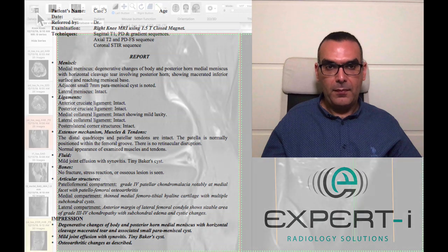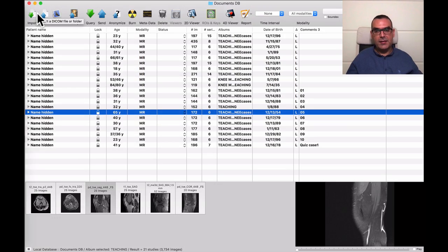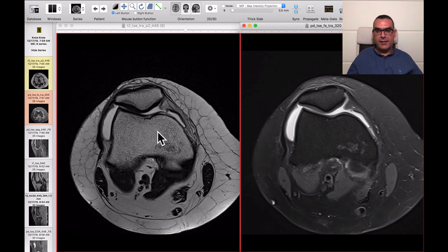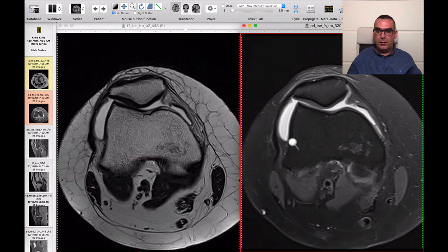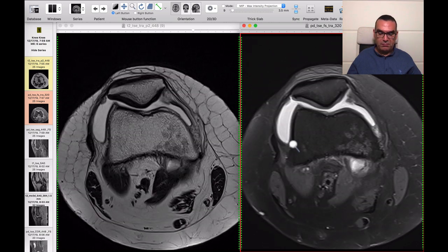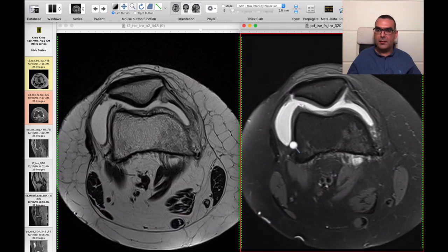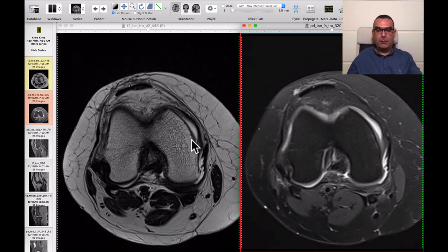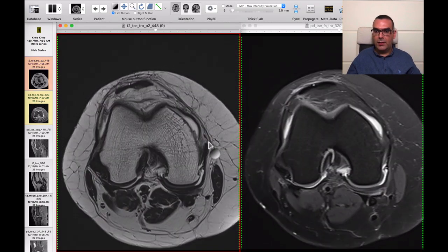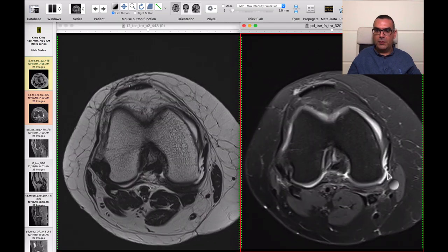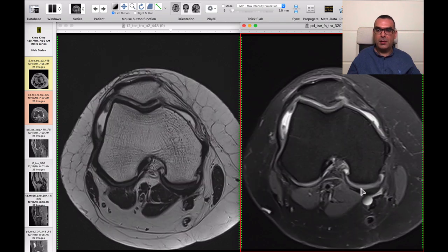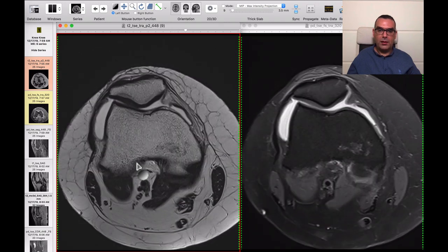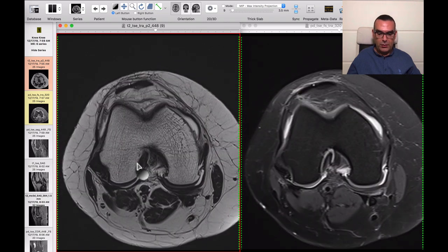Now let's switch to the last case for this session — Case 6. Starting with the axials. The retropatellar cartilage is slightly thin but there are no chondral fissures or ulcers. There is a significant amount of joint effusion. Medial and lateral collateral ligaments are nice, the posterior oblique ligament looks good, there is a tiny Baker's cyst, and the ACL attachment is clearly inserted at the lateral femoral condyle with no pathology.